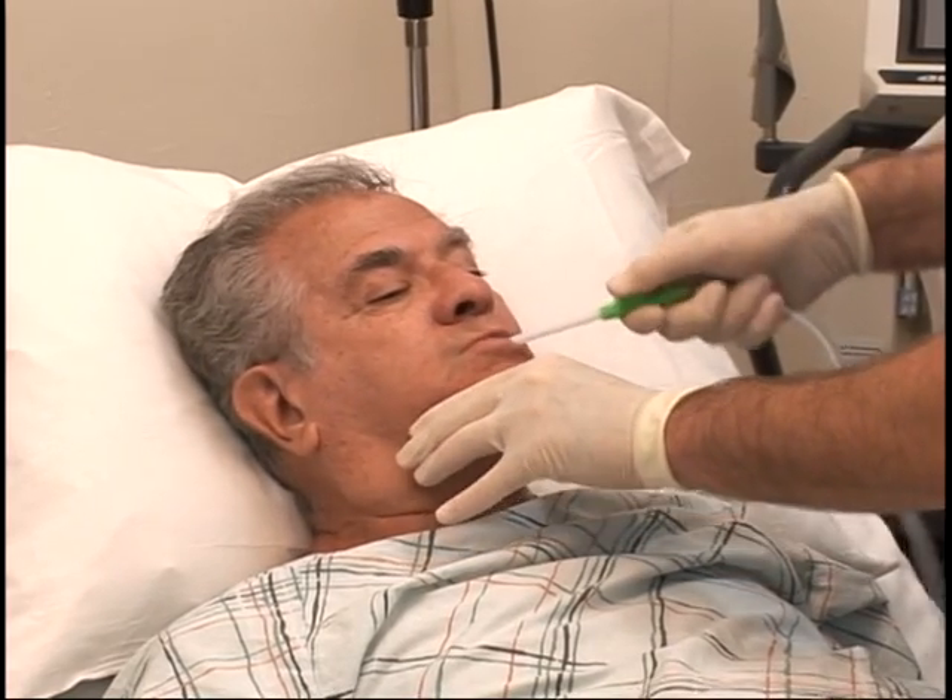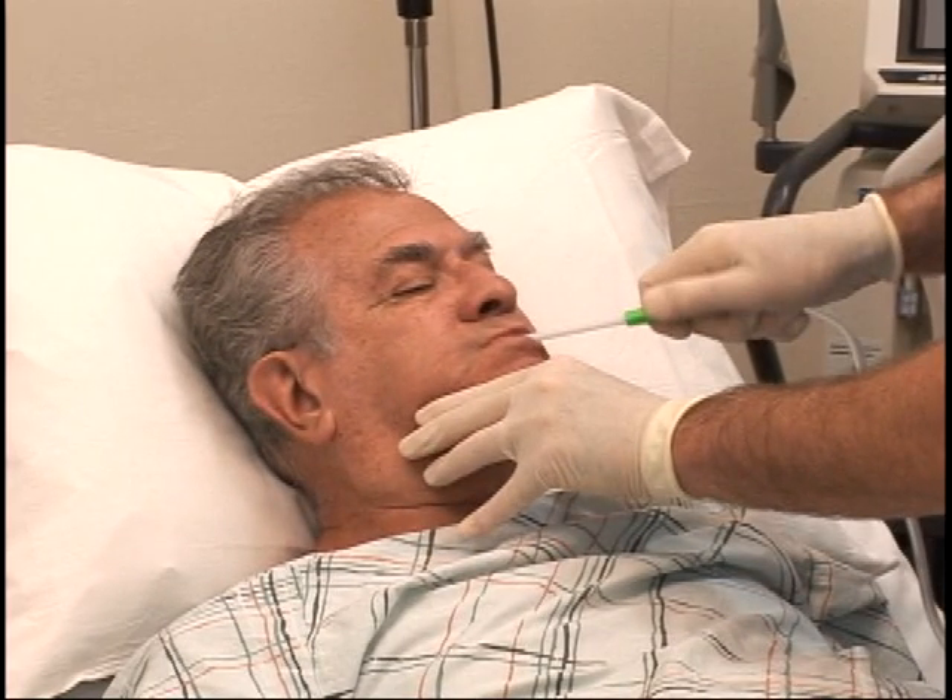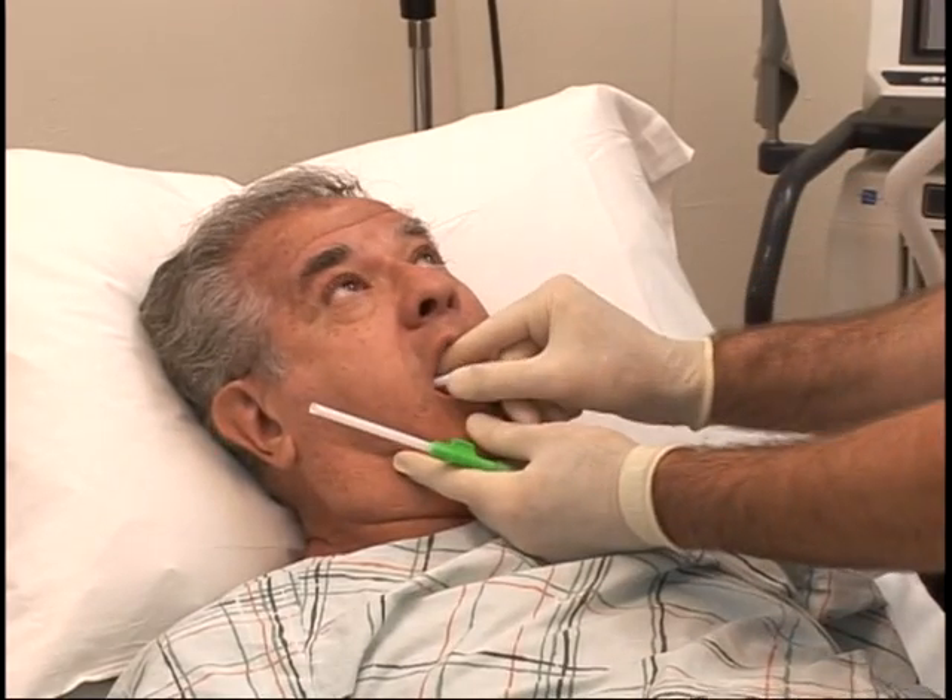But when the patient bites down, it can be very difficult and unsafe for both the caregiver and the patient. The process of suctioning these pneumonia-causing secretions could be stopped, and a piece of hard plastic could break off inside a patient's mouth and cause injury.